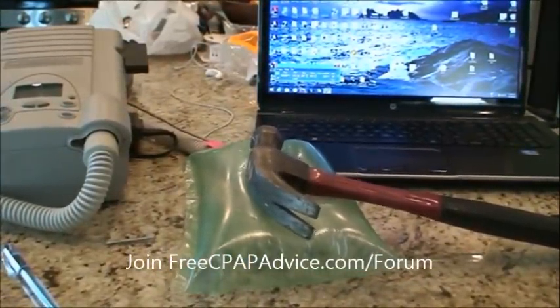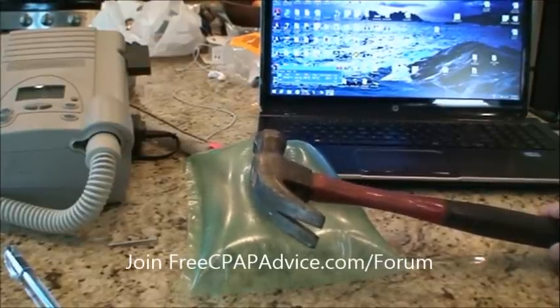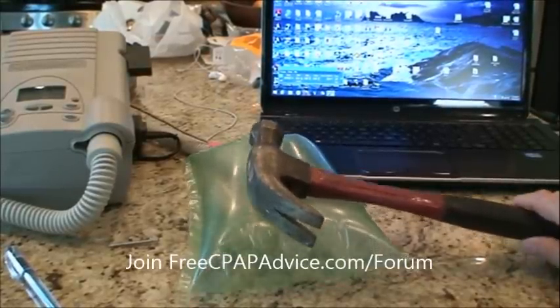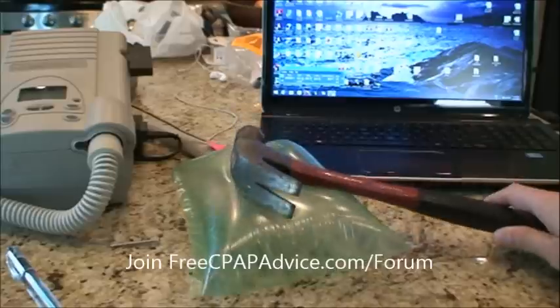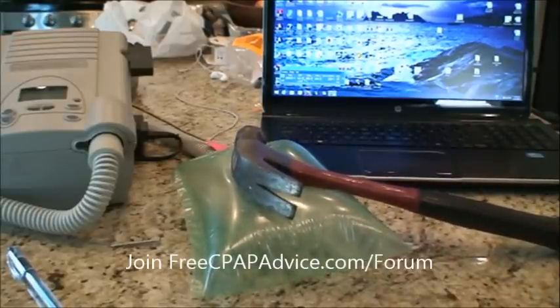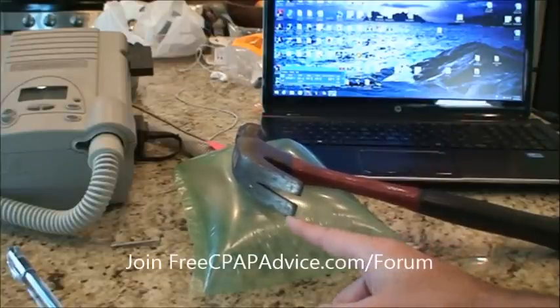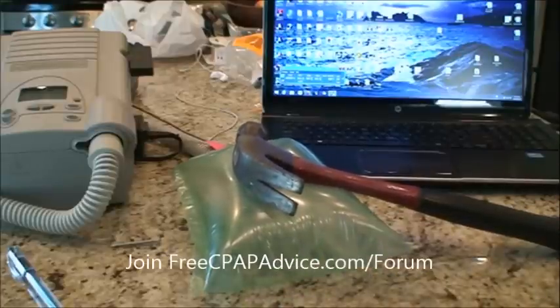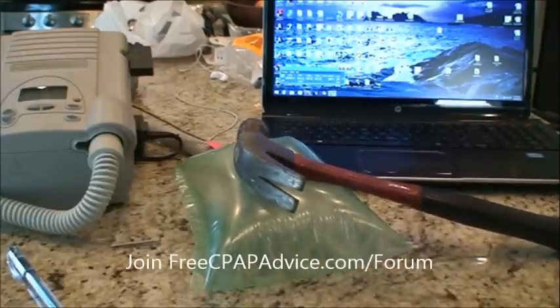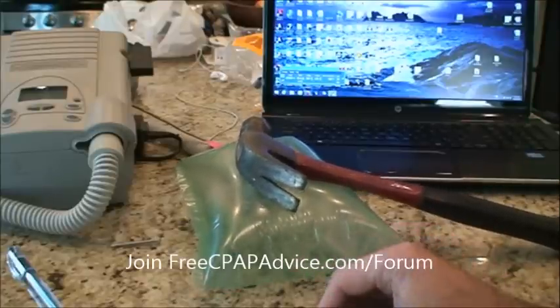So increasing to 8. Whoops. It's starting to fall off. Okay, leak is at 20. We're going to increase to 9. And I would have to say that that is probably pretty well protected. I'm actually going to increase it to 10. 10 is kind of an average pressure if you were to force me to pick an average pressure. And that puts our leak up at 20.